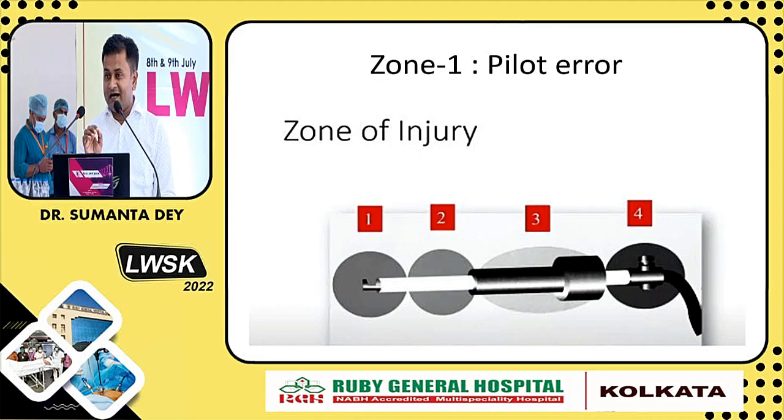And these are very high electrical sources. Even a small touch of electrical energy can later develop into duodenal injury in the post-operative period. The duodenal injury can lead to duodenal perforation. Then if you are touching the bile duct, later it can develop bile leak or biliary stricture. So you have to be very cautious. You have to be trained enough.